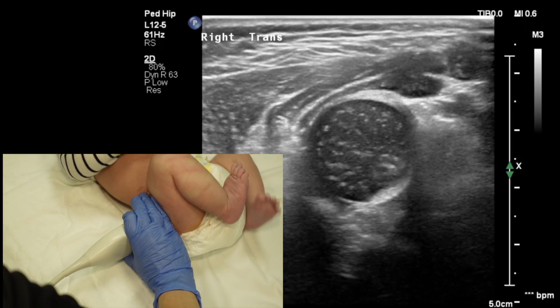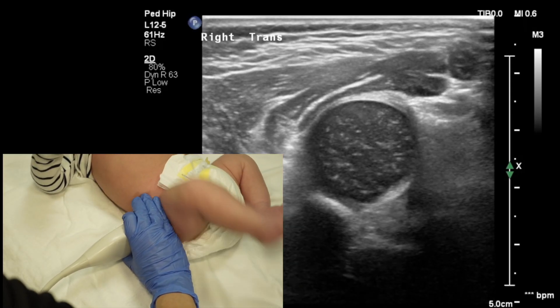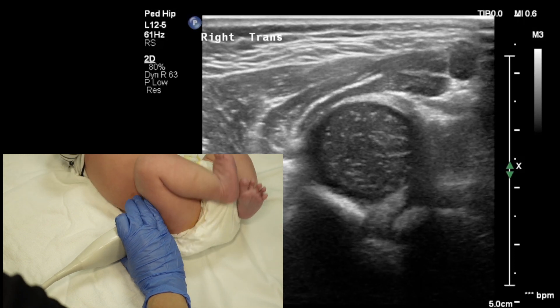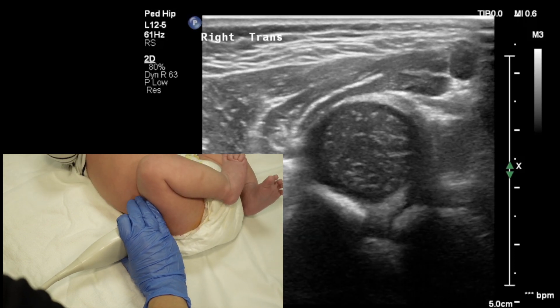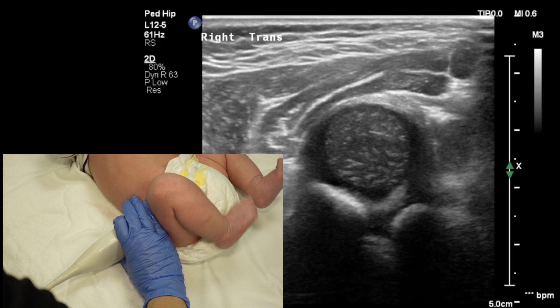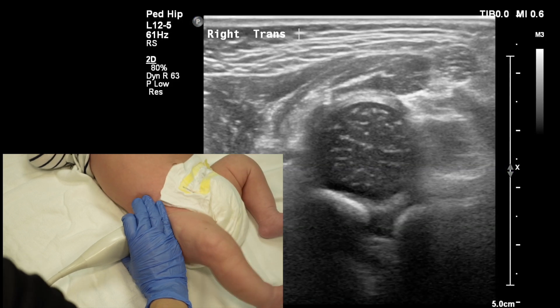This is how trans images are obtained. Note the location and orientation of the probe — it's again somewhat posterior and is perpendicular to the orientation from before. And this is the still image from the trans orientation.